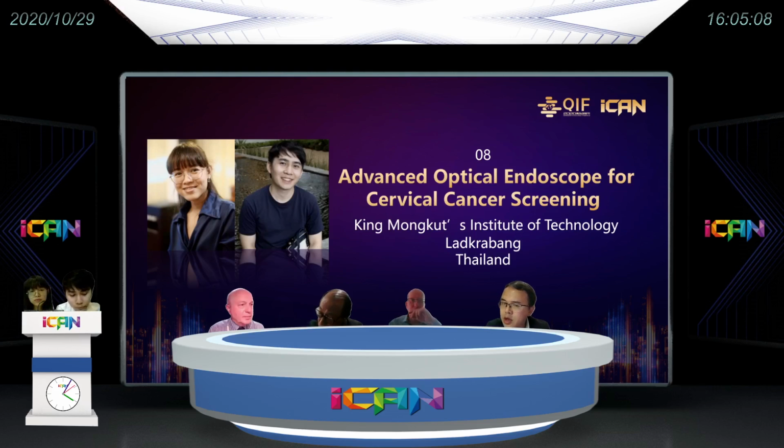In your result, both images have some background with a lot of small circles, right? Those circles are the fiber bundles. Can you get rid of this background by showing a purer image of the cells? Yes, we can eliminate those bundle edges by using some image processing.